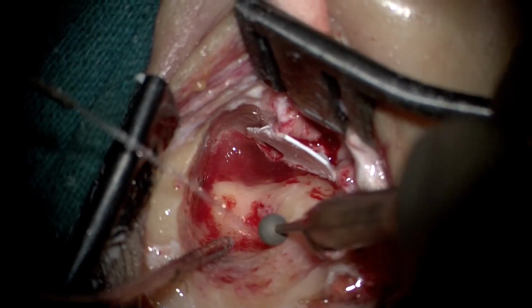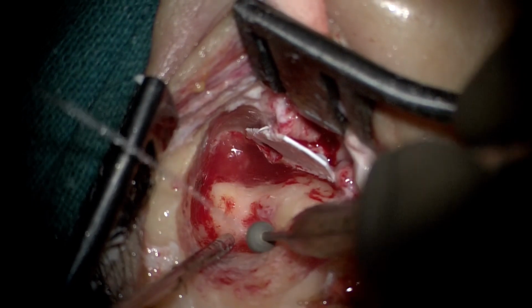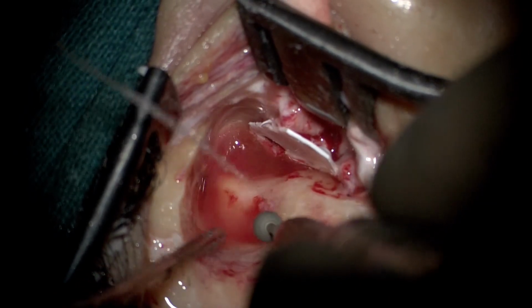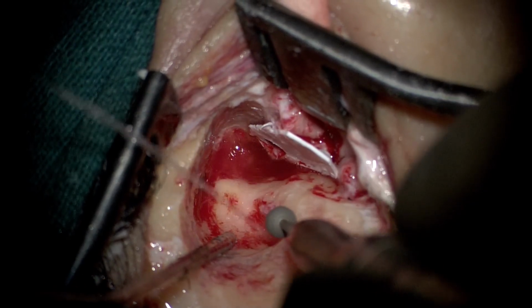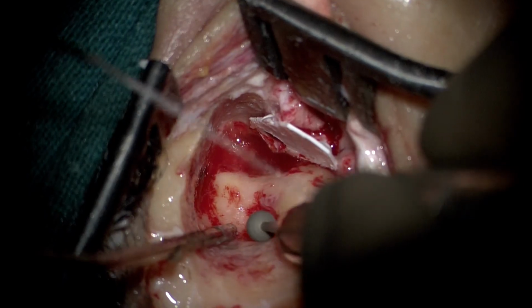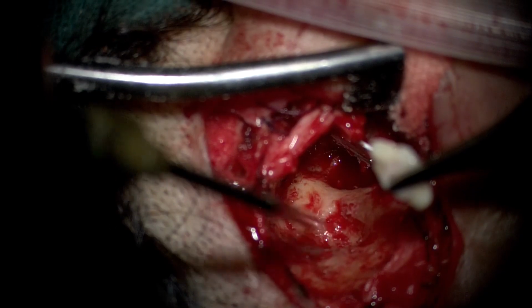Once again, it's very important to clear off disease and drill all the irregularities as much as possible. Remove any buried mucosa wherever you can see it to completely clear the disease, because as long as the bone is clean, you don't have mucosal weeping, and these cavities heal very well in the post-operative time.